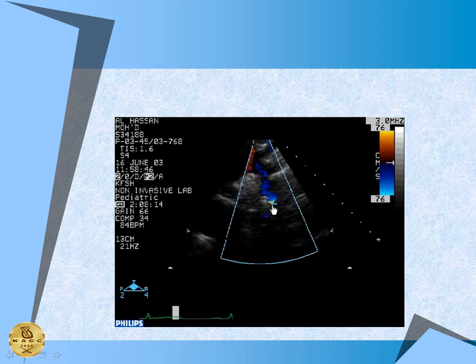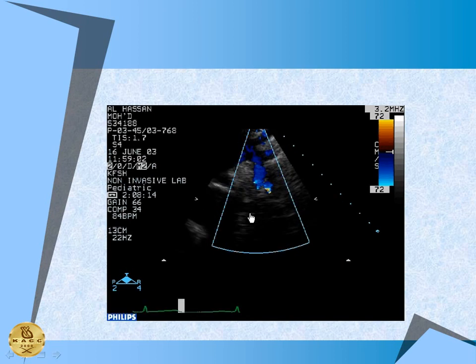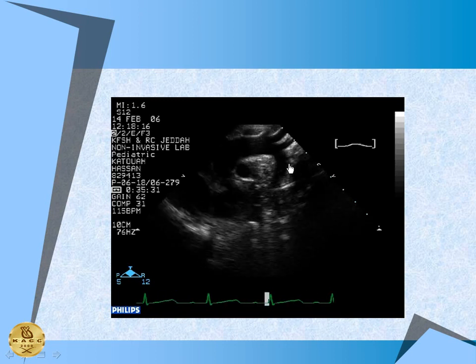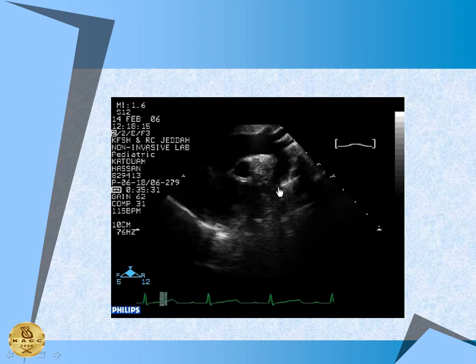And look at this tight coarctation. And it's quite low again, but it's not very low because we still see the PA there. This is the same patient. Just gonna go. So where is this coarctation? Is there a coarctation in this patient? Any answer? Any taker?